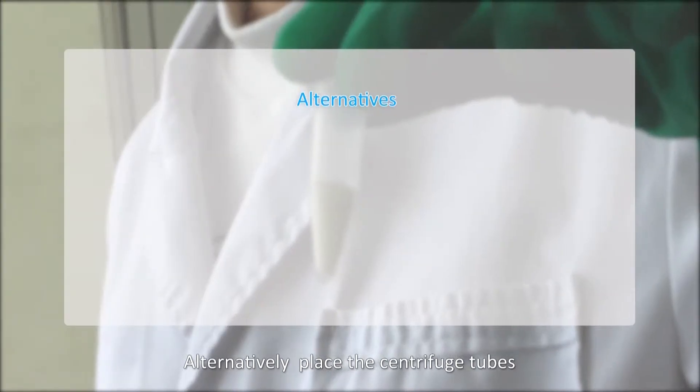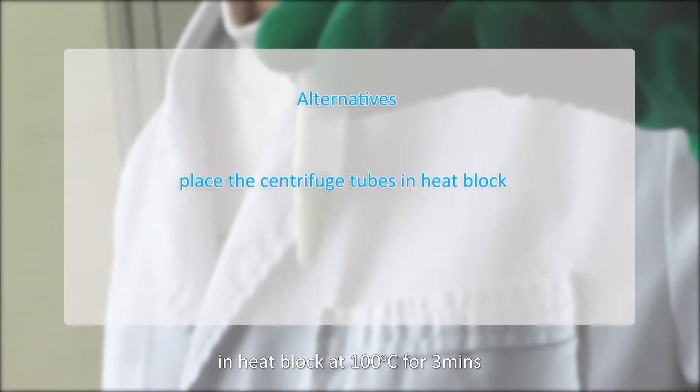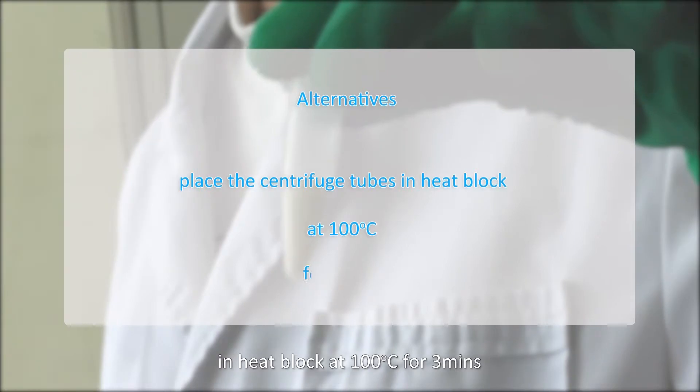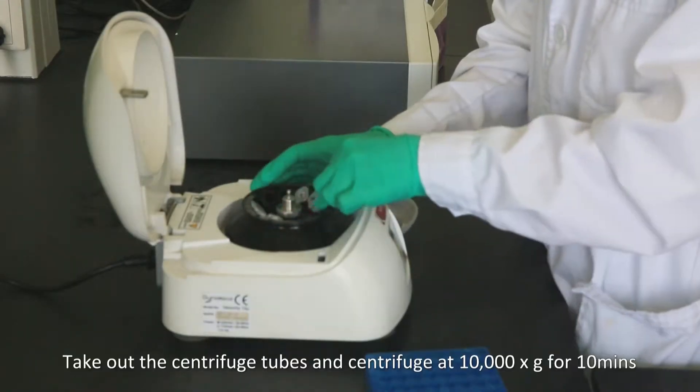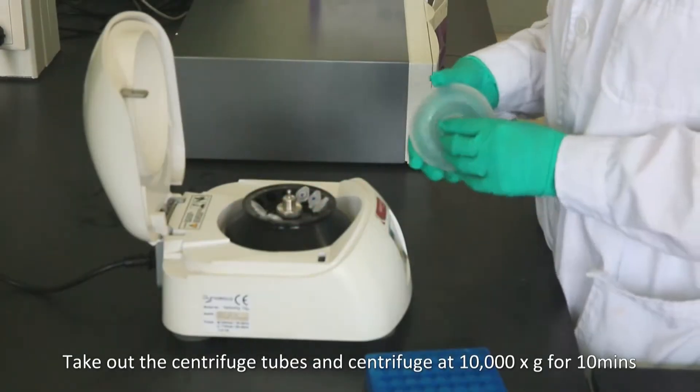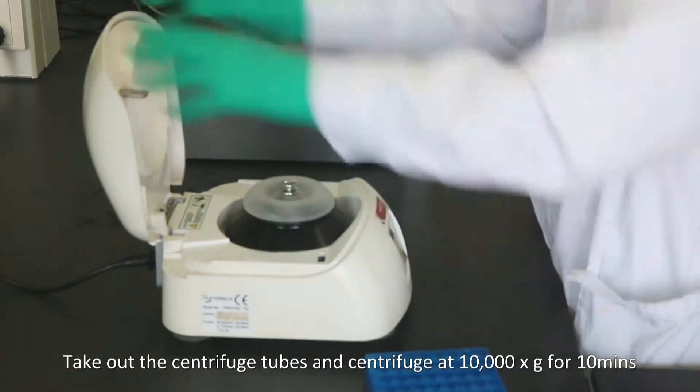Alternatively, place the centrifuge tubes in heat block at 100 Celsius for 3 minutes. Take out the centrifuge tubes and centrifuge at 10,000 g for 10 minutes.